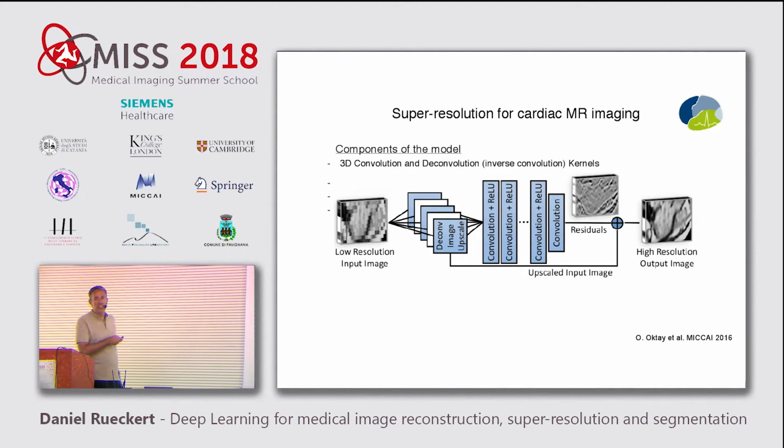So the problem is that I'm not acquiring this as a 3D K-space. Each of these acquisitions, and you'll see this in a moment, each of these slices is a single breath hold. So basically, I'm acquiring the 3D data in multiple different acquisitions. Now, this ground truth 3D data set is actually a single 3D acquisition with a 3D K-space.